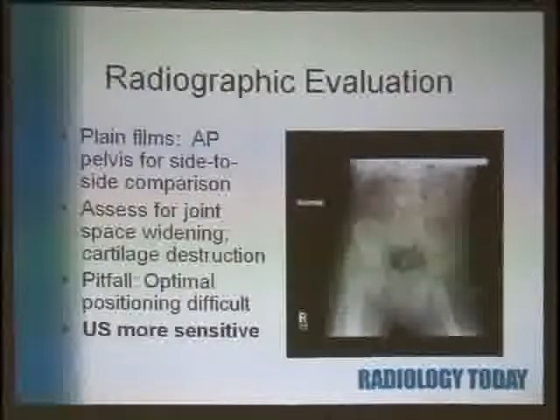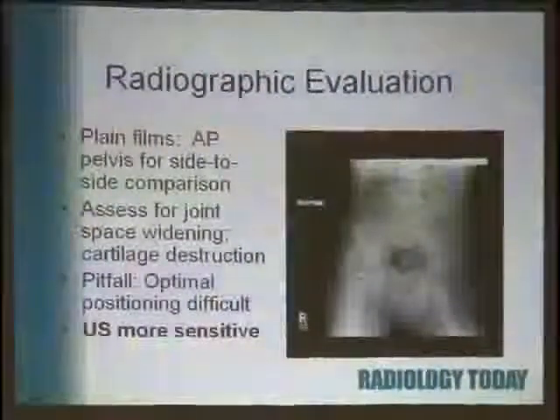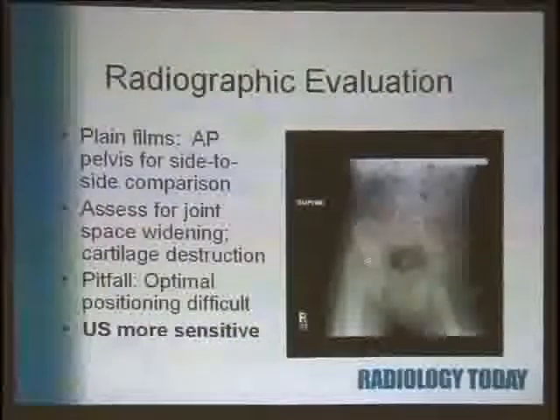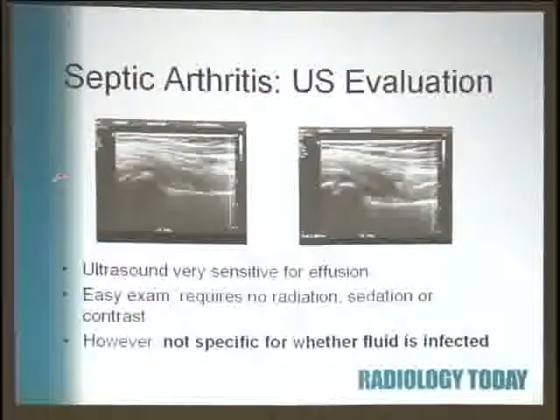And as we can see, these are 2 pictures of the right and left hip from the same patient. Now what you're looking at, Amy, if you go back real quick, is here's the epiphysis, and then the growth plate, and then the metaphysis. So when we do the ultrasound, we lie them flat down on the table, we take a linear transducer, and we're right there over the joint space. So then go forward. So this is what we're looking at.